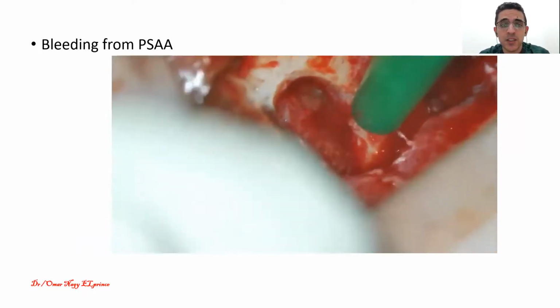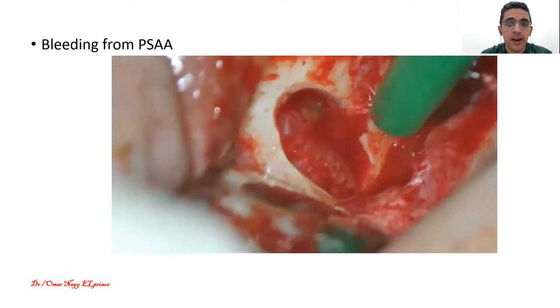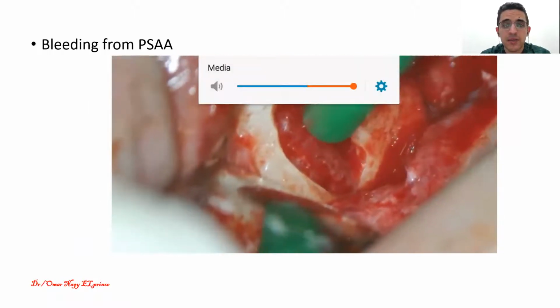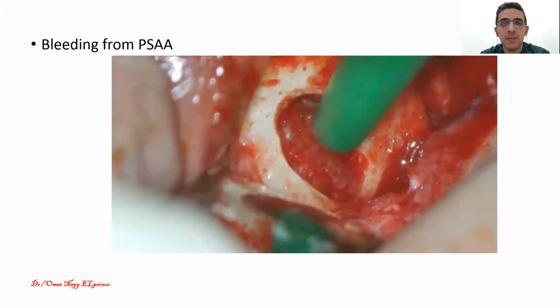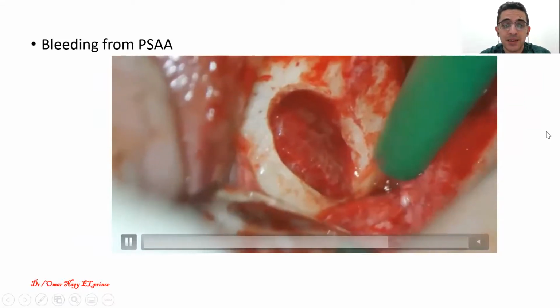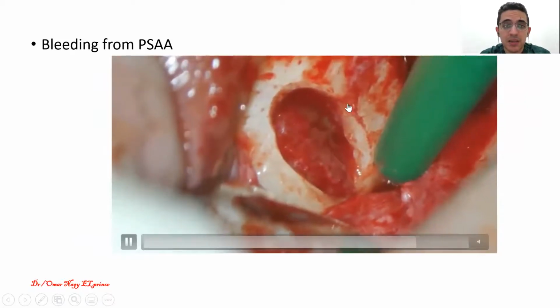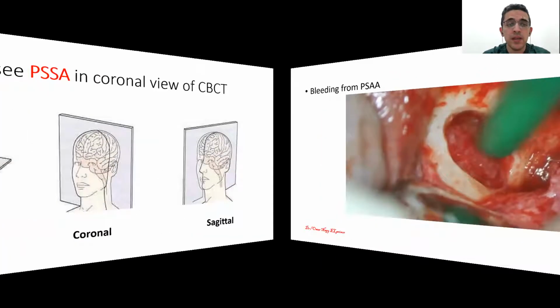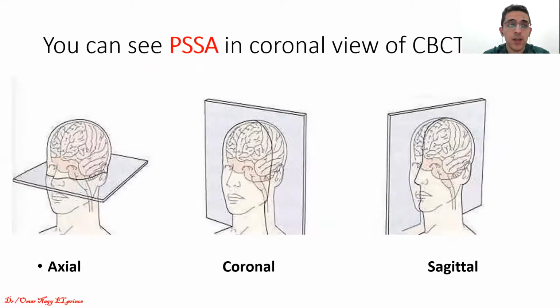يعني as you can see here in this video we are now making a Caldwell-Luc approach. Just we are trying to make in this operation a sinus lift. بس احنا لقينا ان في بليدنج، فالبليدنج ده لازم نبقى عارفين انه من البوستيريور سوبيريور الفيلار ارتري. وas you see here it's pulsating لان هو artery، فايتس pulsating like this as you see. اوكي you just know ان انت ممكن تواجهه، ولو واجهته هو بالبريشر ممكن ان انت توقفه. يعني just بالبريشر باك هو eventually بيقف. Don't get terrified.